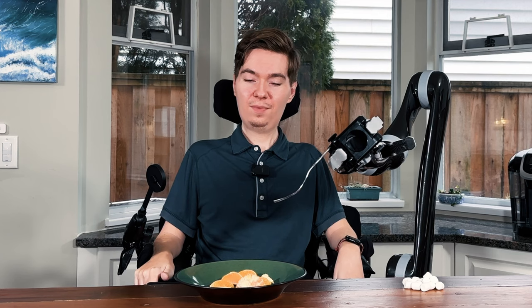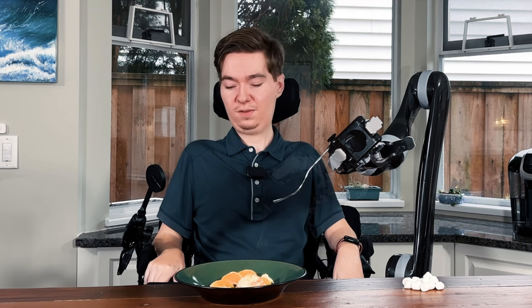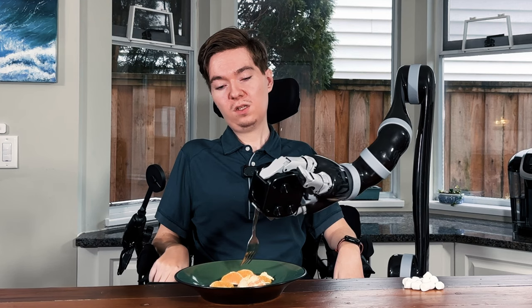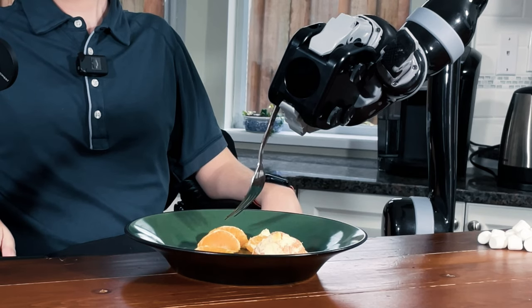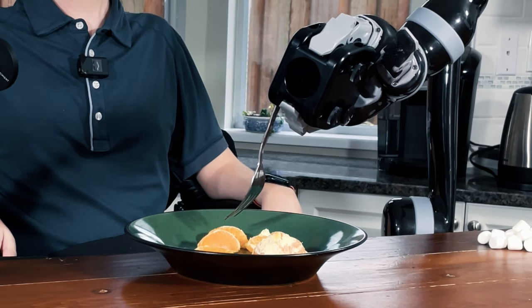With our oatmeal out of the way — that went very well — we're going to try some different things. Jayco works excellent with fruits and vegetables because they're usually something you can just pick up with your hands. But here in front of me I've got a nice orange, and oranges can be sticky, so I'm going to use a fork to eat them. I think there's a lot we can learn from this process, so let's get to it. I'm going to line myself up over an orange slice and I have oriented the fork at an angle instead of straight down.